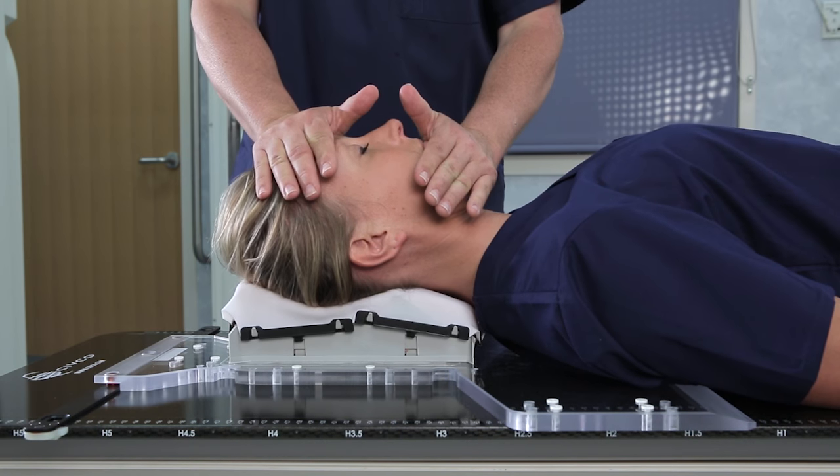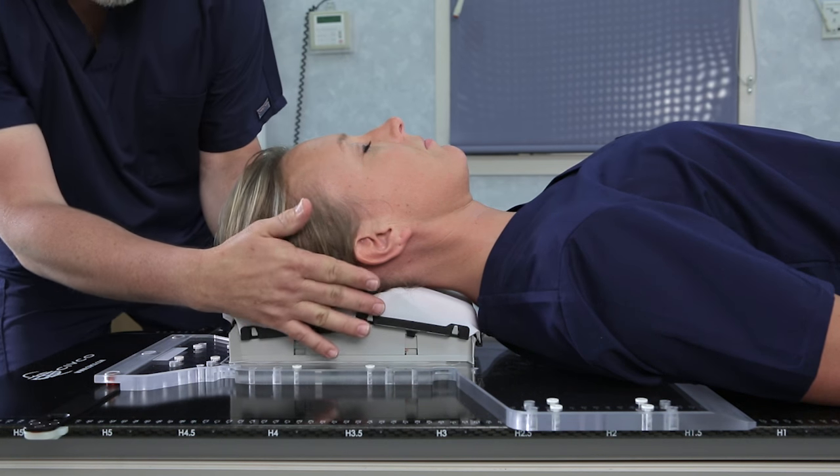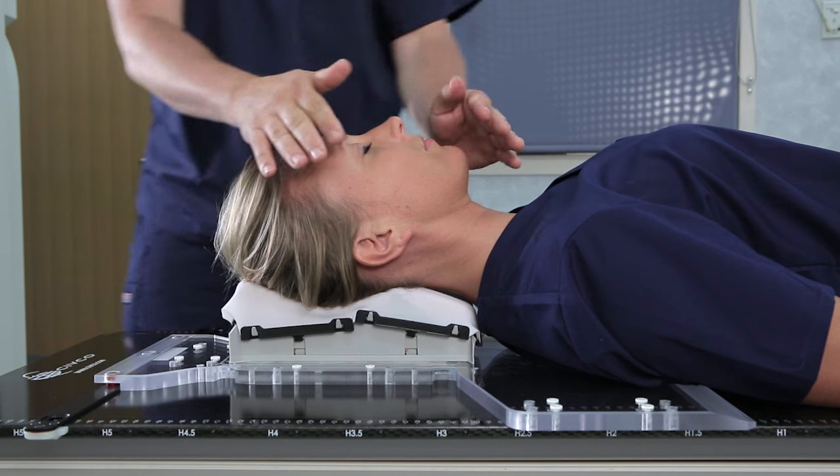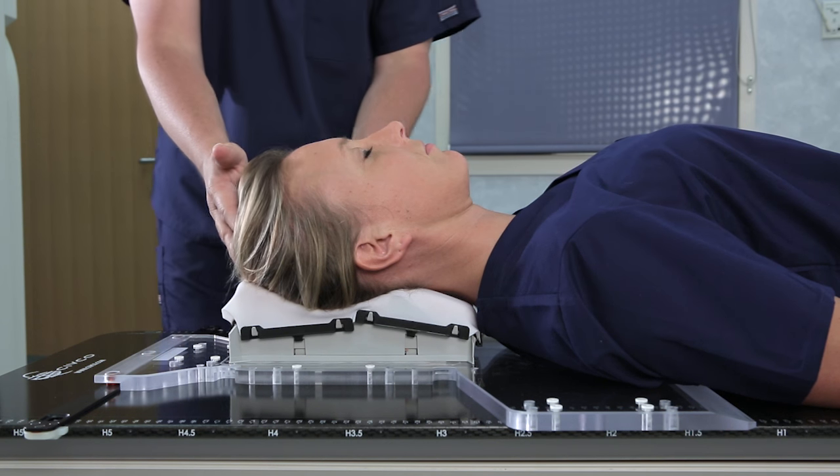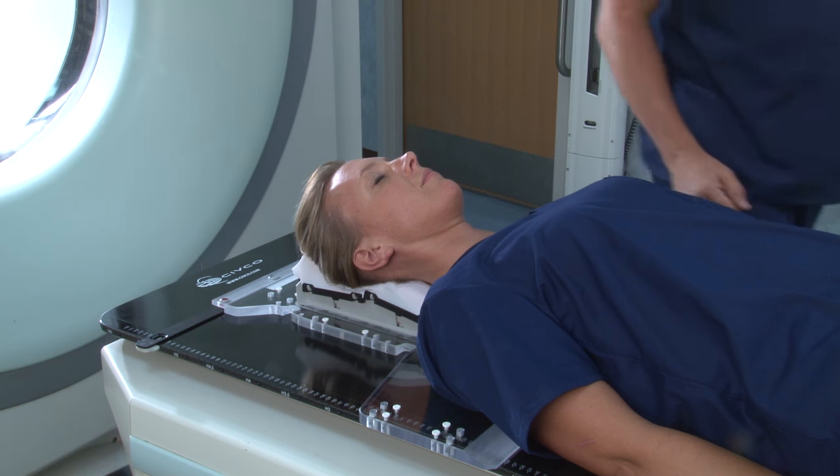With one hand over the forehead and the other over the chin, apply two straight down compressions with enough pressure to ensure a quality deep impression. Allow the thermoplastic to cool for five to ten minutes.